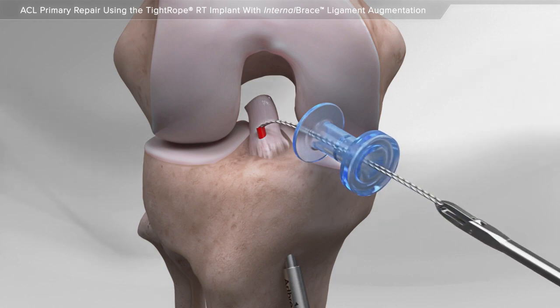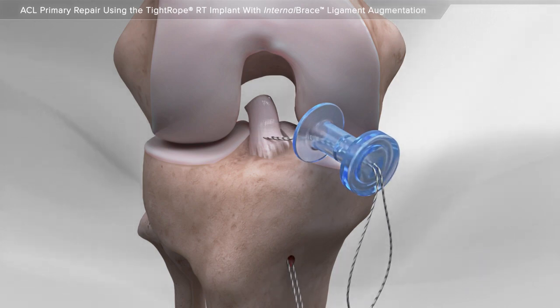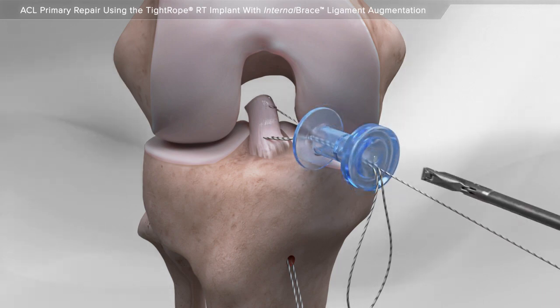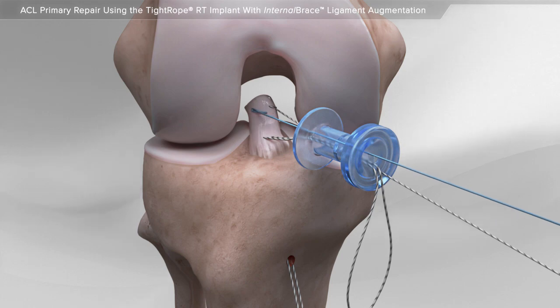First, suture is placed in the intact healthy portion of the ACL. And two additional repair sutures are passed through the ligament that is torn away from the bone.